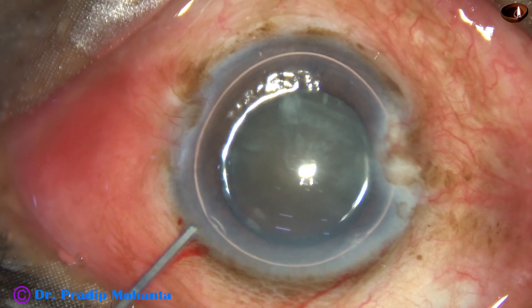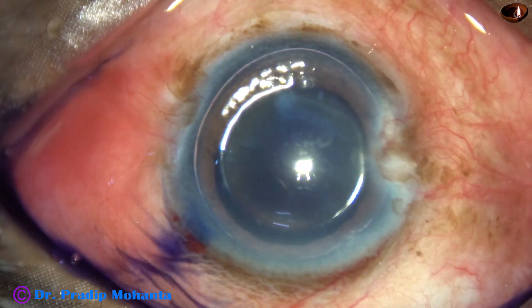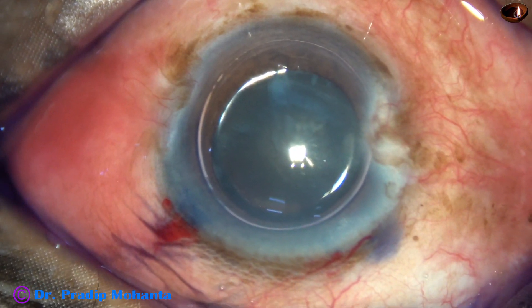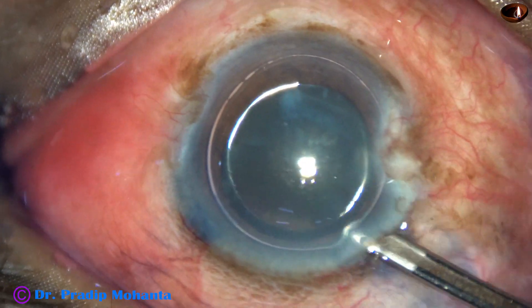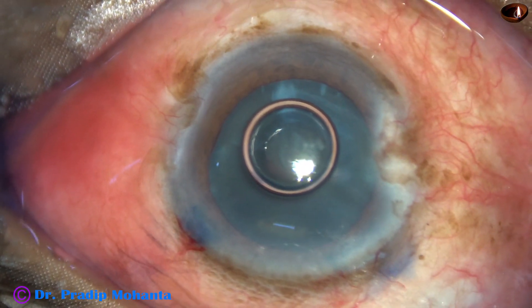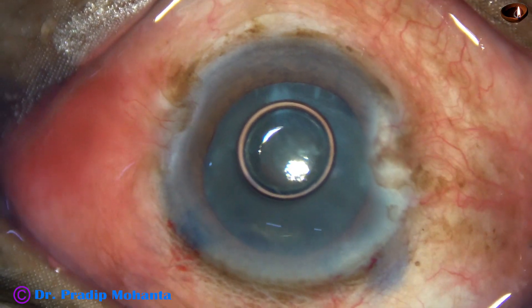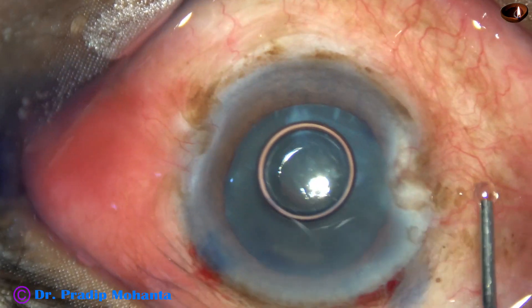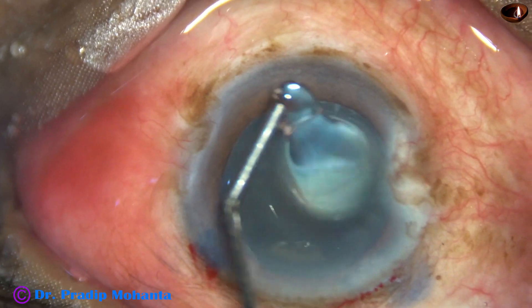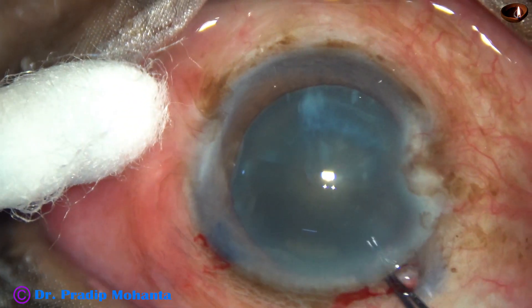By this time the main incision and the side port on the left side of the main incision have been made. The anterior capsule is stained with trypan blue dye. This is a bit of adrenaline. I wash the dye nicely and then inject Visco. We use 2% hydroxypropyl methyl cellulose. We don't use sodium hyaluronate. The methyl cellulose is applied over the cornea.